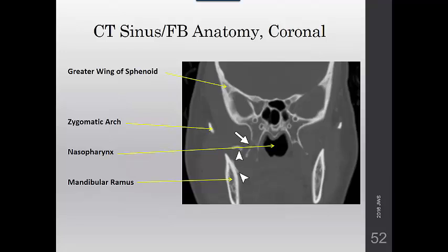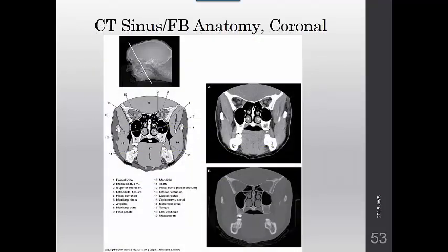The following three slides are from your text. They're coronal views, and there's one that I didn't post on the presentation, but it's included in your text, and I would encourage you to learn this anatomy. It covers the orbits, facial bones, and ocular muscles, the nasopharynx region, and the muscles of the face. Protocols for sinuses and facial bones are at the end of the chapter. They are very similar, but there are subtle differences. So when you look at those protocols, just keep that in mind.